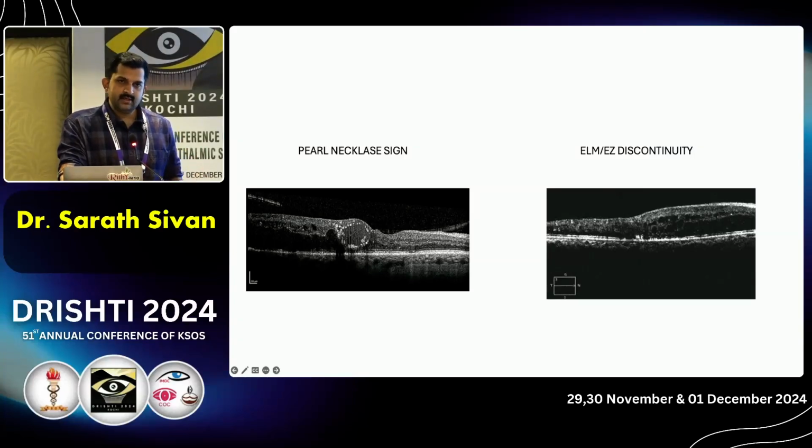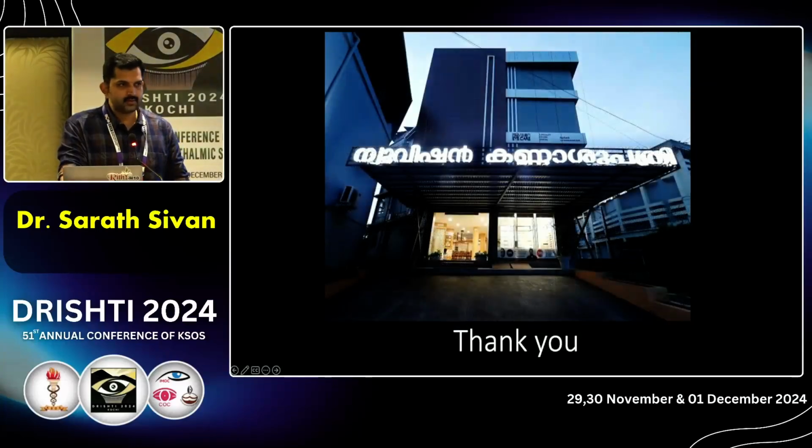Thus, OCT in diabetic macular edema gives a lot of information, from diagnosing the disease to the severity of the disease, and some clue regarding the systemic condition of the patient. So it plays a very valuable role in the management of DME. Thank you.